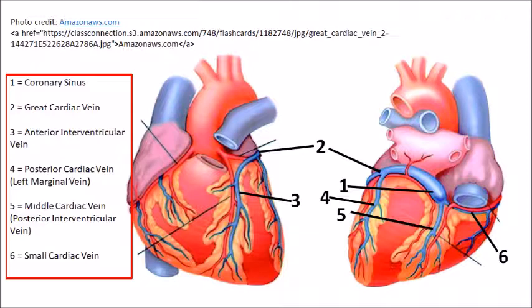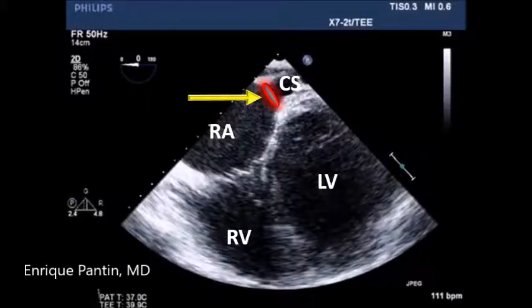Here the cardiac veins are shown. From an initial four-chamber view and with a slight advancement of the probe, we saw the entrance of the coronary sinus, indicated by a red circle and arrow.